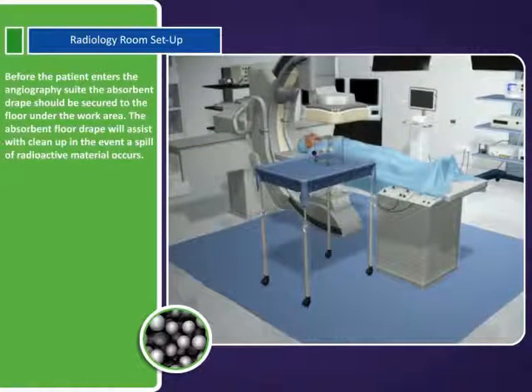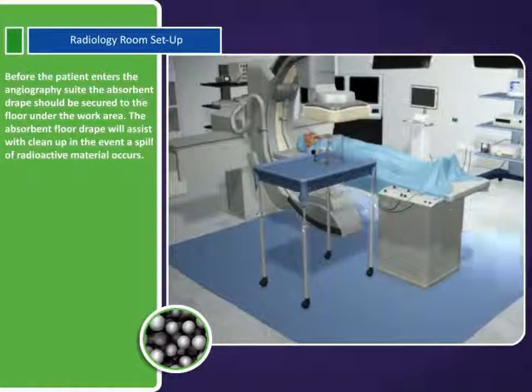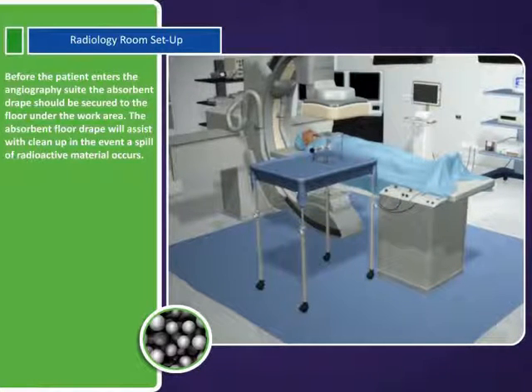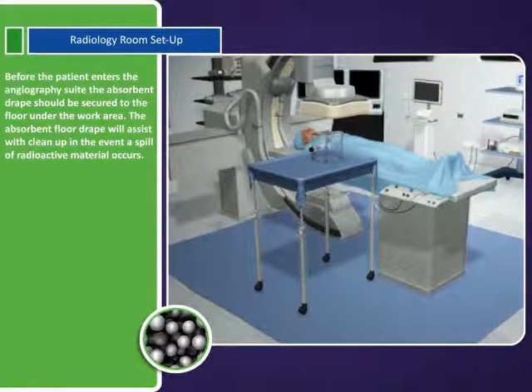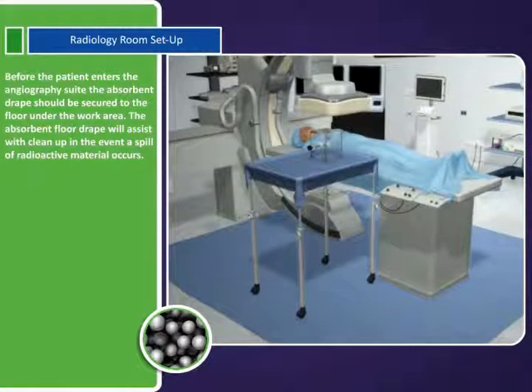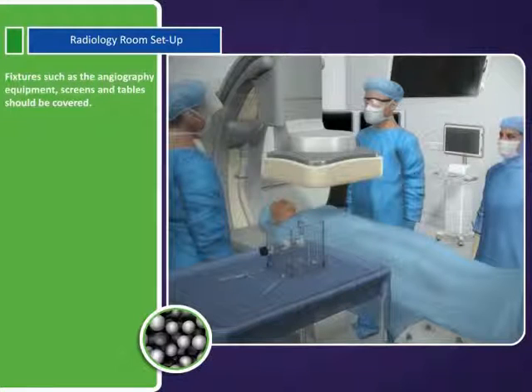Before the patient enters the angiography suite, the absorbent drape should be secured to the floor under the work area. The absorbent floor drape will assist with cleanup in the event a spill of radioactive material occurs. Fixtures such as the angiography equipment, screens, and tables should be covered.